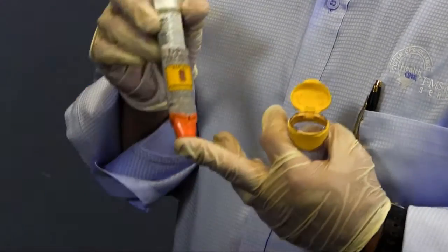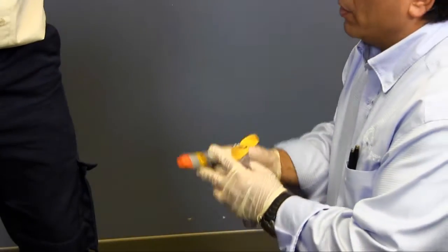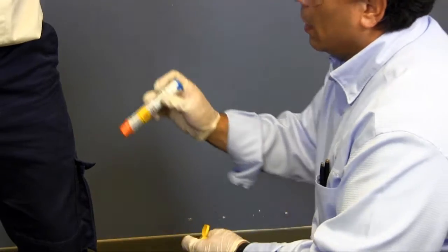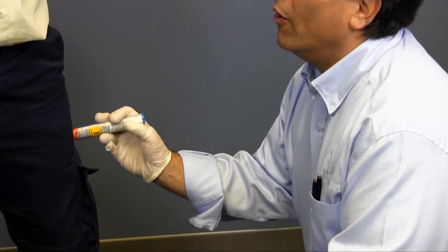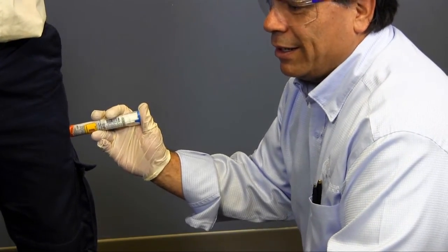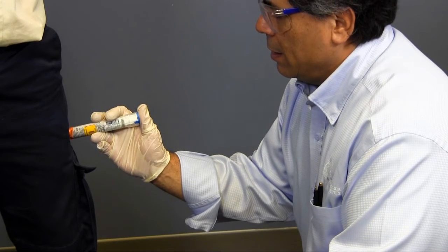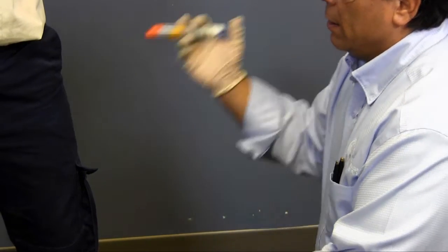I call medical control for an order to administer the autoinjector. Once I have the order, I remove the safety cap and insert the autoinjector pen firmly into the lateral thigh. Hold it there for 10 seconds confirming the medication is administered.